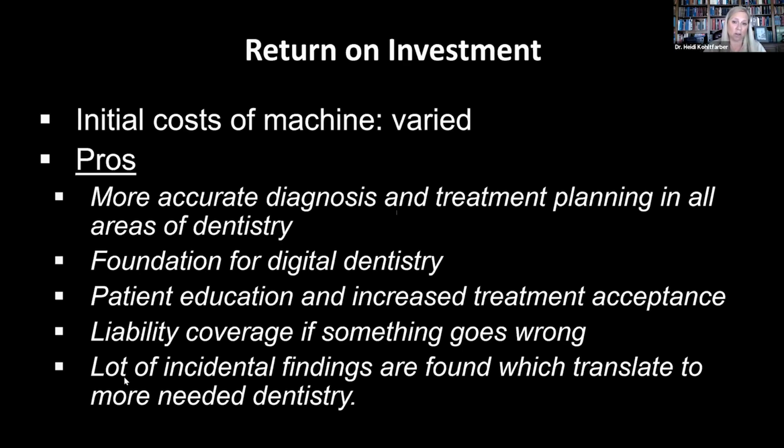Liability coverage if something goes wrong. A lot of times people say, well, I don't want a CBCT because of the liability of owning it. That's not what we're seeing reflected in the lawsuits that are occurring. We're actually seeing it's a greater liability if you don't have the CBCT and you're not taking the 3D imaging.